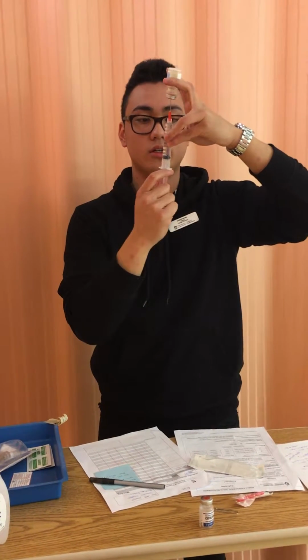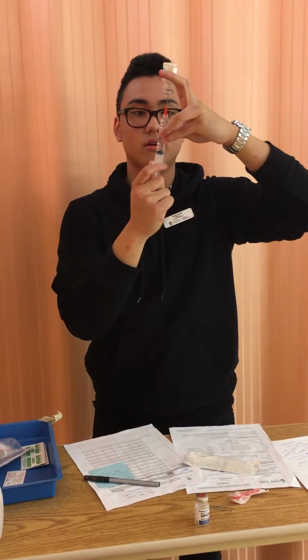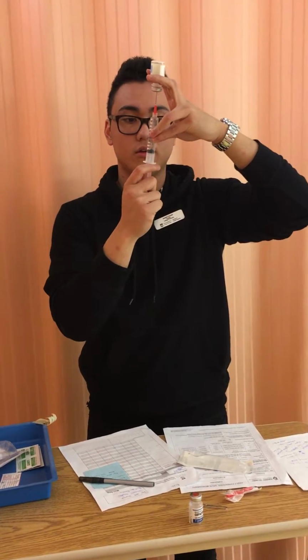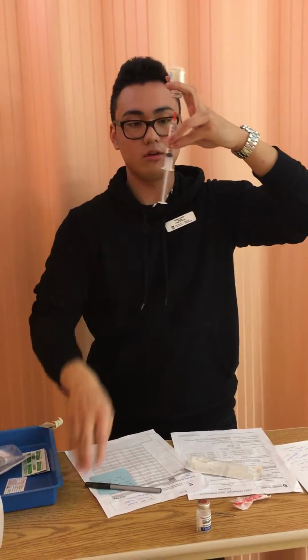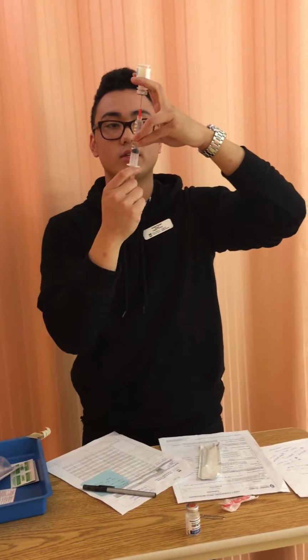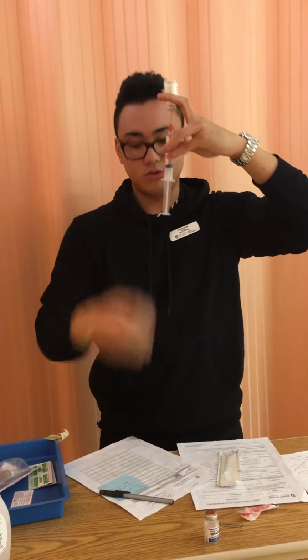Any air bubbles there? I'm changing it right now. Getting rid of any air bubbles because that will affect the amount of sterile water we do draw up.